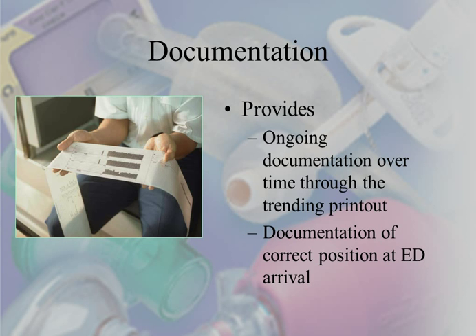For us, the trending gives us ongoing documentation over time through the trending printout, and documentation of the correct position at emergency department arrival. So what you don't want to do is not call the hospital, not tell them what's going on, and the next thing you know, they're all sitting in the doctor station, not paying attention while you roll in with your patient. So make sure you paint a good picture for them.